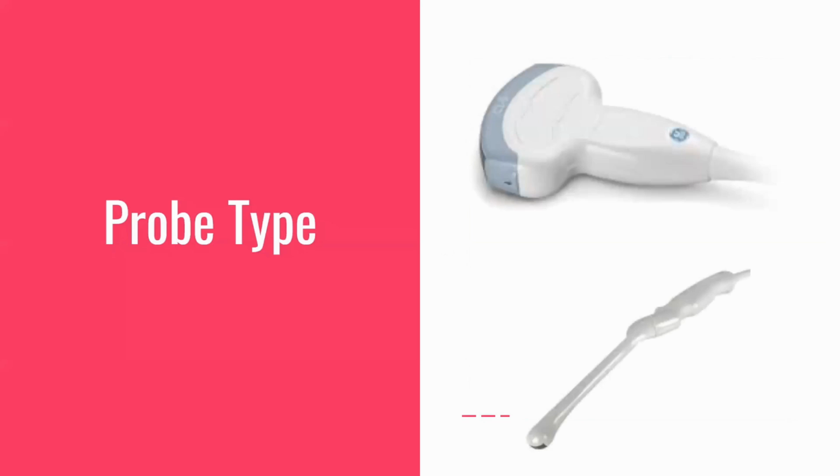So, probe type, you can really do this with either probe. Today, we're going to be focusing on transabdominal ultrasound, which will be best performed by the low-frequency curvilinear probe. This gives us a bigger picture of what's going on with the uterus and the adnexa all in one. Whereas you can get a more detailed image with the transvaginal or endocavitary probe. And it has been shown that POCUS can also be done pretty quickly and effectively by emergency physicians with transvaginal probes, and certain centers do perform this regularly, but it is much less common.